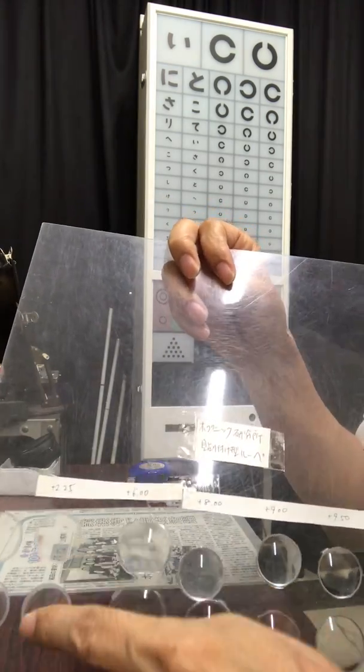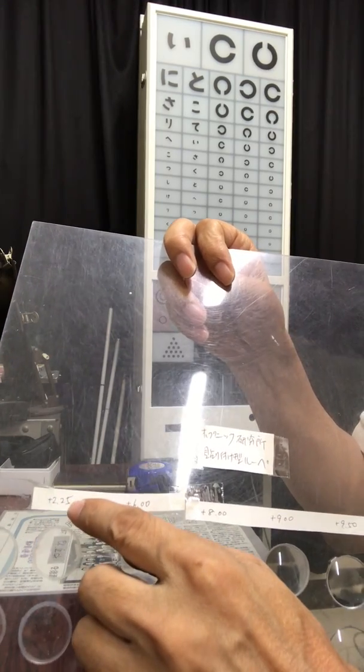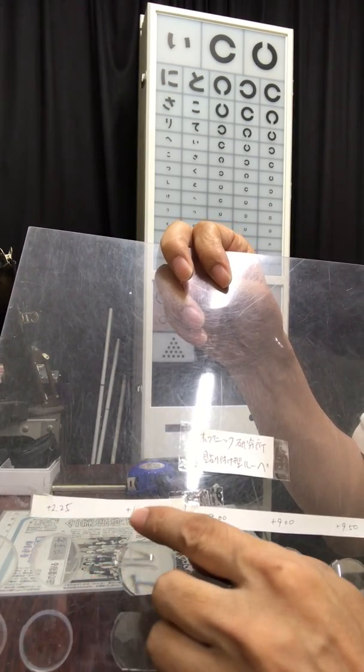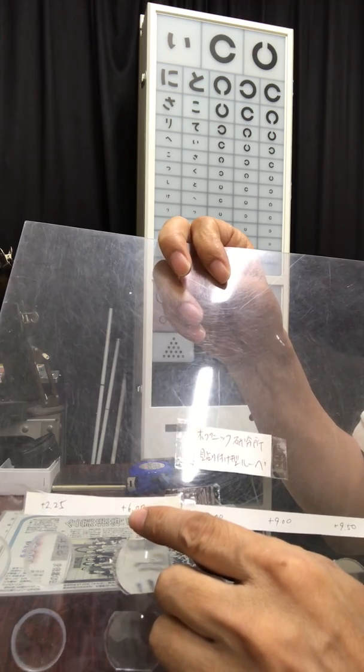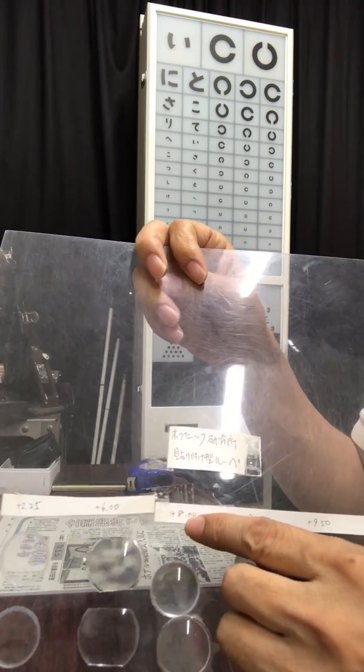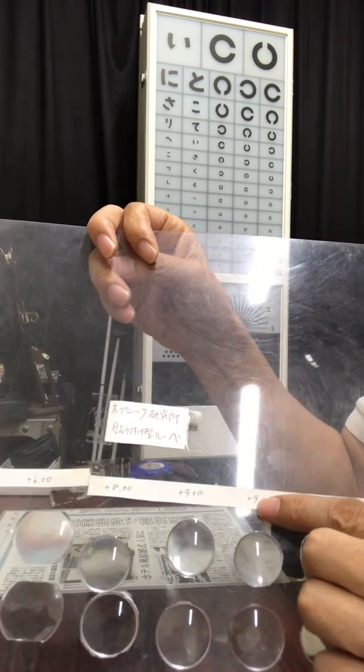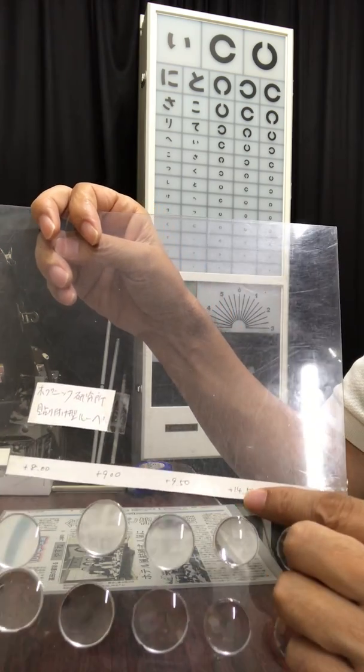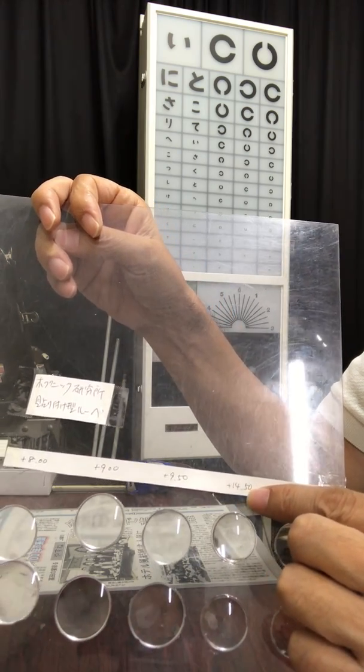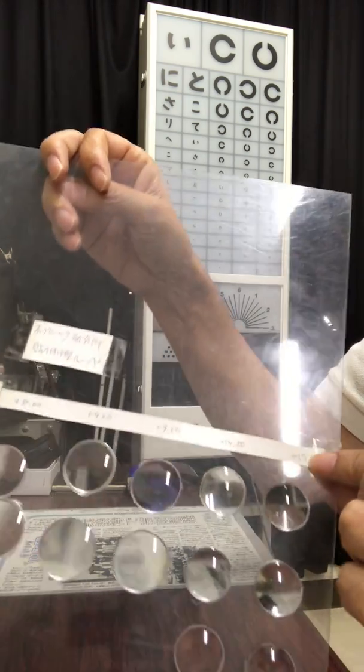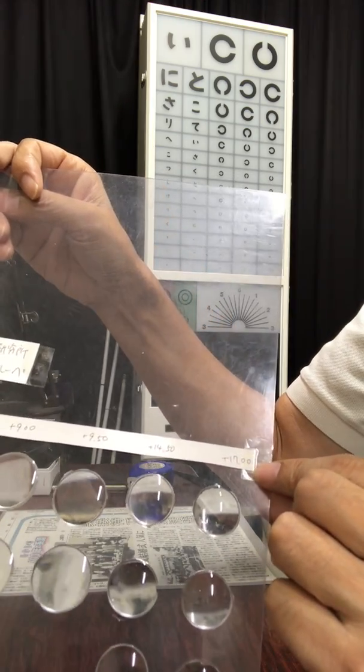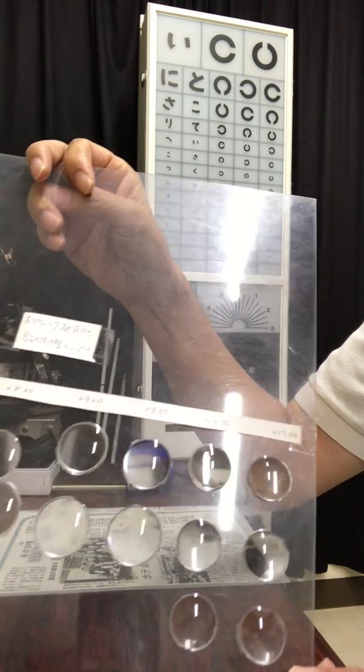It varies from 2.25 diopter to 6, 8, 9, 9.5, 14.50 to 17.00 diopters.